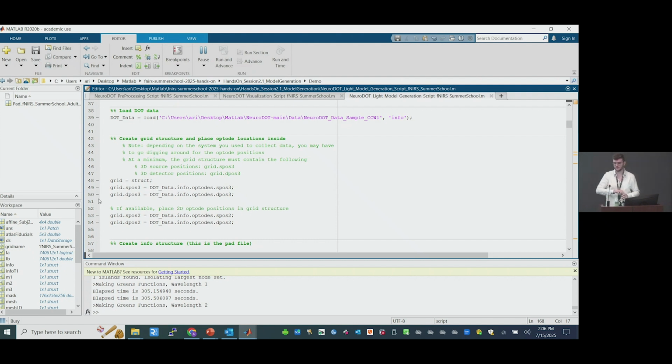We have a question in the back as well. Thanks. Once you've worked out the X, Y, and Z coordinates of where you want your pad to be on the actual array, can you have that preset, and then, if you have different measurements for different people, run that automatically to generate the A matrix for each participant without having to go into the align me?